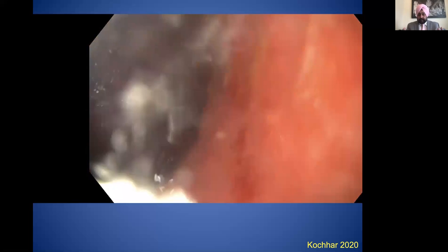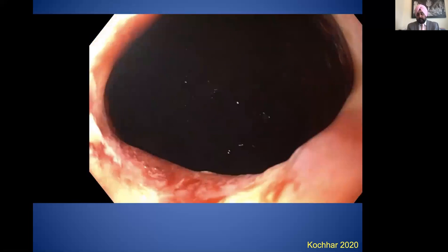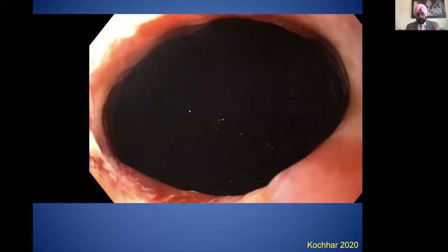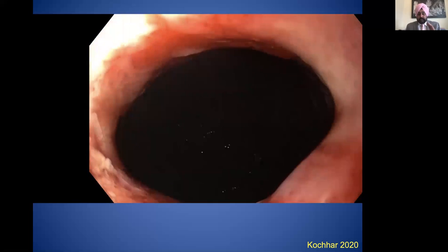And as you can see, the pouch is inflamed as there was fecal stasis. Patient was having symptoms. The stricture immediately looks bigger than before. I have followed this patient since, now it's been almost a year. She's had repeated 2 pouch exams with me. I had to not do any more cutting. Stricture is still widely patent.